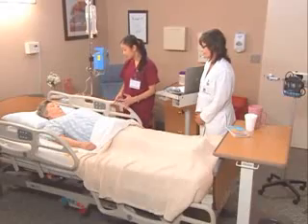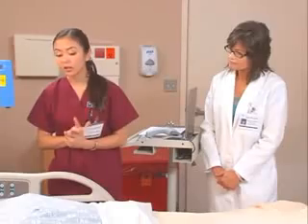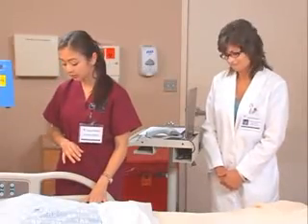Well, my head spins from time to time. Does that count? No, but let me know if that happens while we're taking the measurements. Okay, so you have to lie here for a few minutes, then we'll measure. I'll put the cuff on the other arm since I see this IV is on your left.